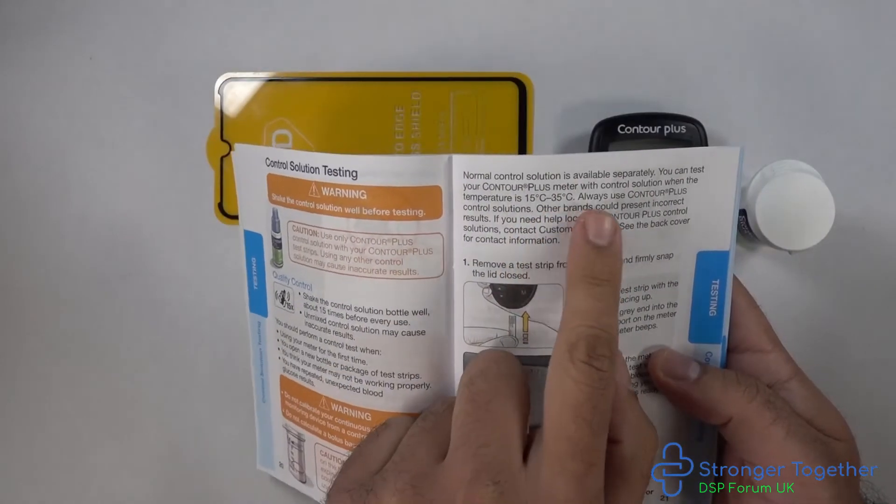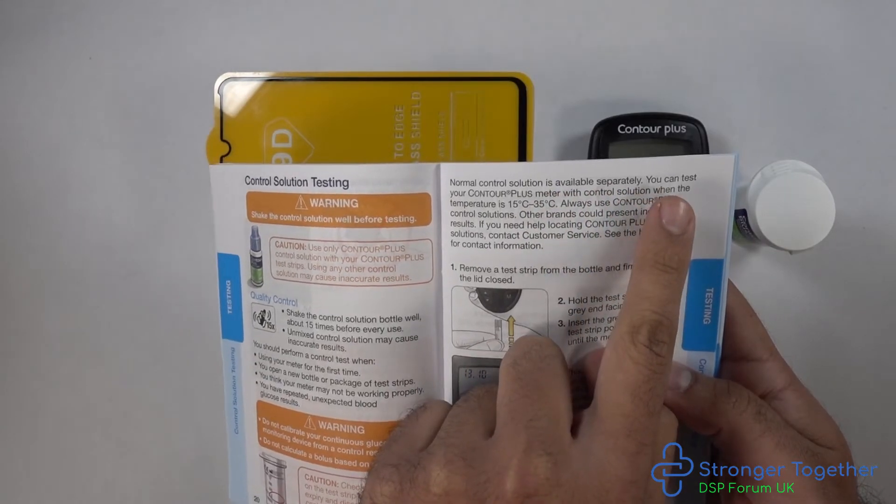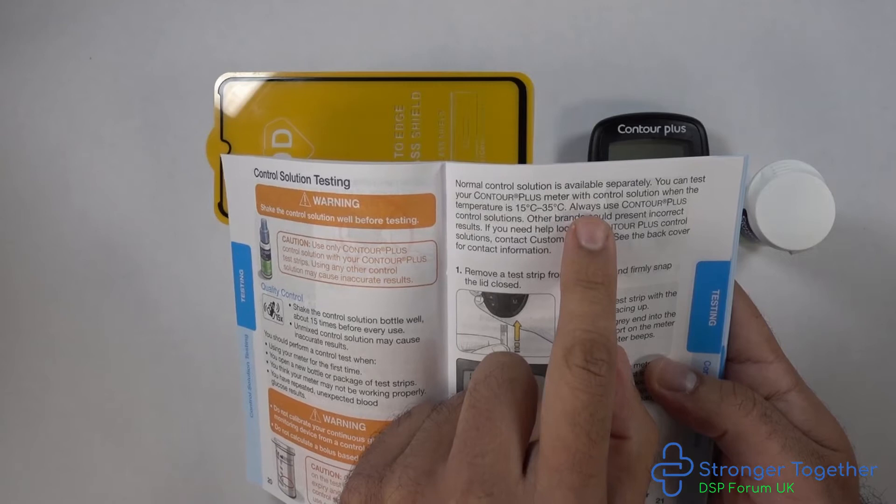The test can be performed between the temperatures of 15 degrees and 35 degrees Celsius. Remember, only use the Contour Plus control solution.